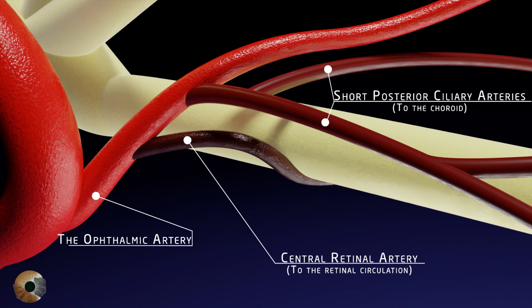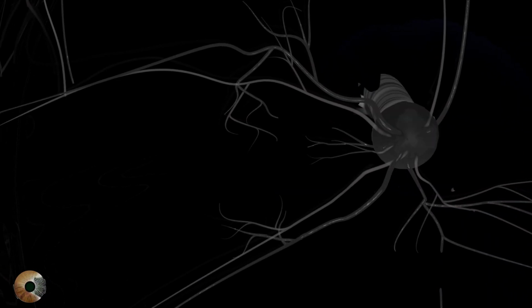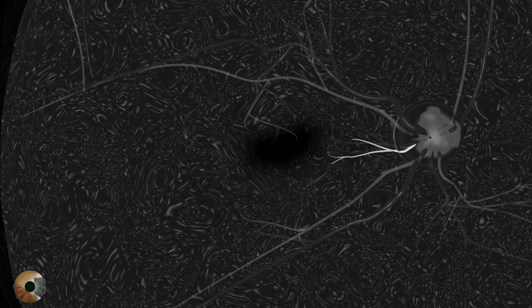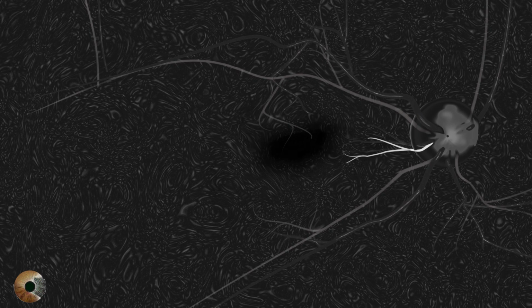The choroid lights up first, not because of anatomy, but because its low resistance, high flow, leaky vessels allow faster dye delivery and extravasation compared to the retina. The dye reaches the choroidal vessels and capillaries after 11 seconds of injection. Filling up the choroid with fluorescence gives it a patchy lobular appearance, which becomes flush due to diffuse filling.